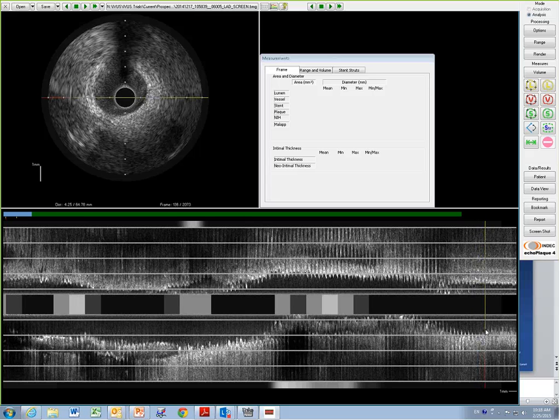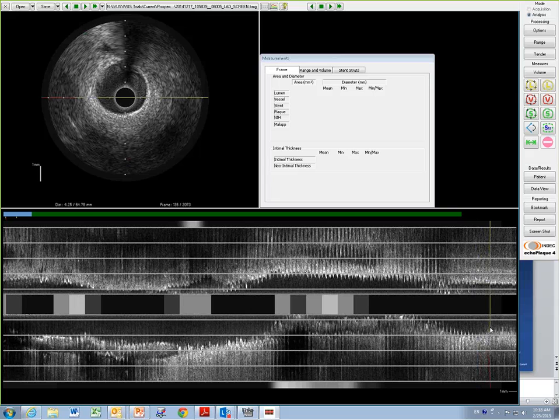But in my opinion, whether the entry point was covered or not is important. And second, usually the hematoma is going to stop if you have a branch or enough plaque, because the hematoma is inside of the media. So if the artery is very diseased, the media is already scarring, and it's very difficult to dissect.